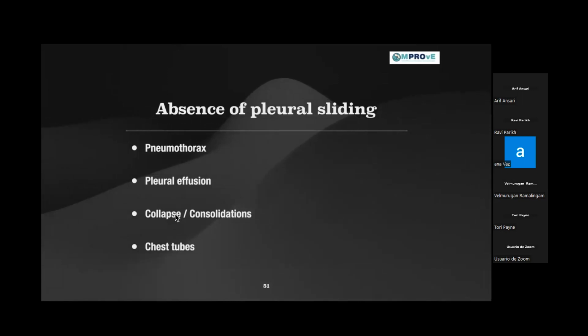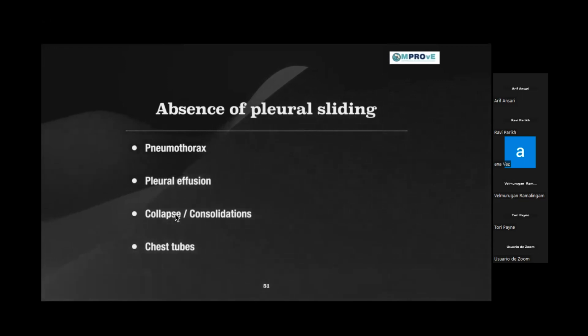In collapses, in atelectasis, say the baby's been ventilated for quite a long time, and suddenly in the morning you do a gas and you see respiratory acidosis, high CO2s, and you wonder what happened. Baby was doing fine, and suddenly there is a rising respiratory acidosis. You do a chest X-ray, or you can decide to do a lung ultrasound.